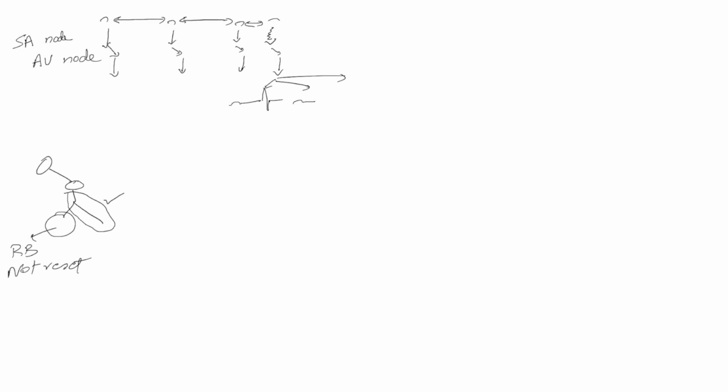So now when a PAC happens, the impulse goes from the aberrant focus through the AV node, and because the right bundle is not active, it would flow through the left bundle and then depolarize both the ventricles. In other words, because the right bundle isn't conducting the way it should, you might see a QRS that looks something like that. Now, following the beat, because the atria has already gotten depolarized, this would go ahead and reset the SA node. And so a normal P wave wouldn't appear where it's supposed to appear, but instead it would be slightly later. So let's say about here or so.